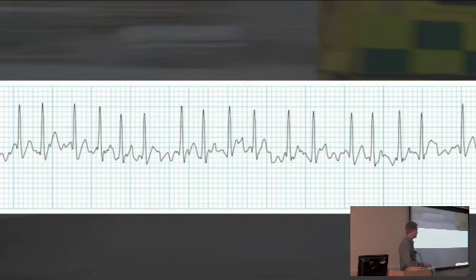AF, yeah, so a spot diagnosis for this one, isn't it? Why is it AF? What makes it AF? Yeah, not a lot else could it be in an irregularly irregular rhythm with decent QRS complexes like this. It's totally irregular, so that's atrial fibrillation. With ventricular ectopics, you'll have an inherently regular rhythm, and then the odd beat that's missed. So that's regularly irregular, because you've got this basically regular rhythm, and then you have one that jumps out. Whereas with this, it's just totally, absolutely no pattern. You could put a piece of paper on there and mark it, and there wouldn't be any pattern whatsoever in atrial fibrillation.